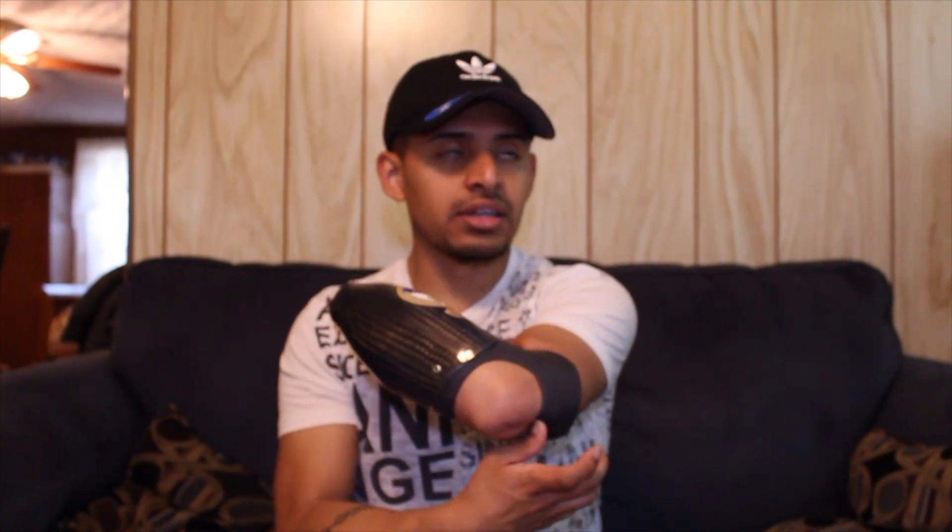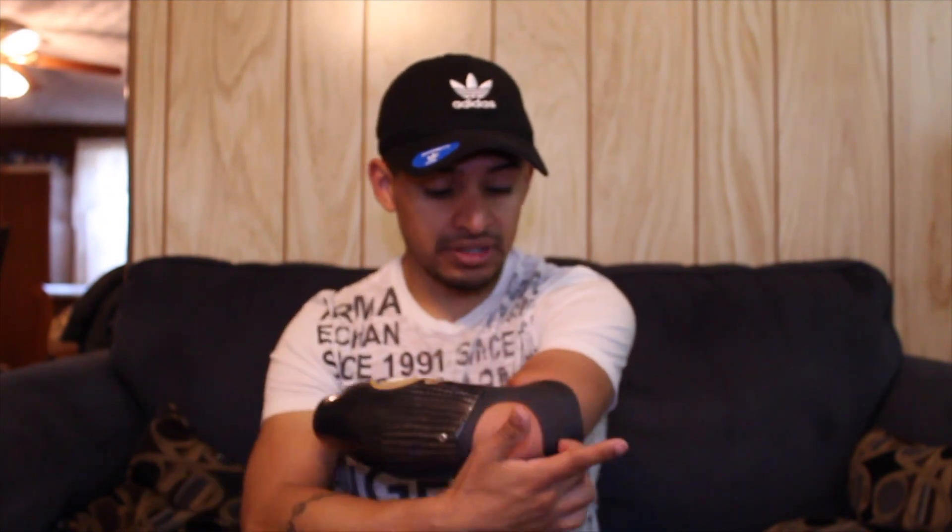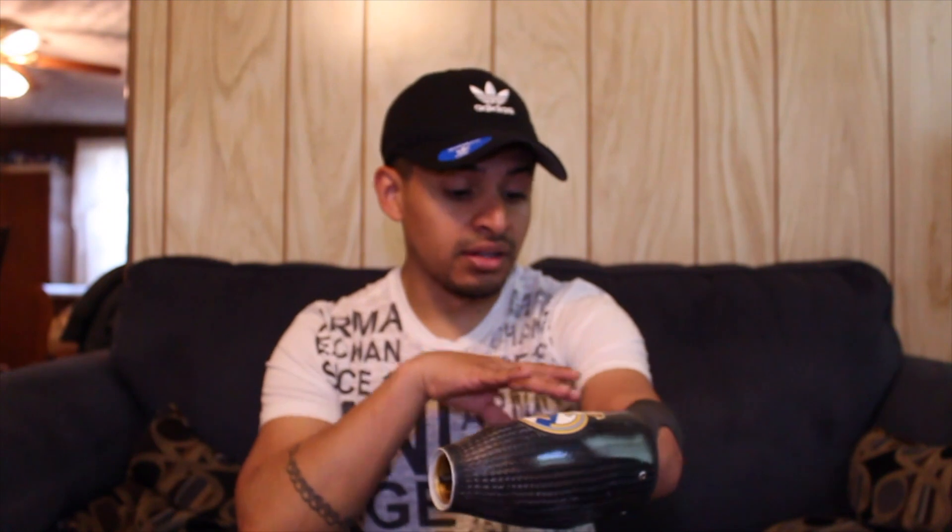Then the part that goes to the elbow — that costs like probably $10,000 just to make this plastic piece, whatever it's called. It's really very expensive just to make the forearm and everything.